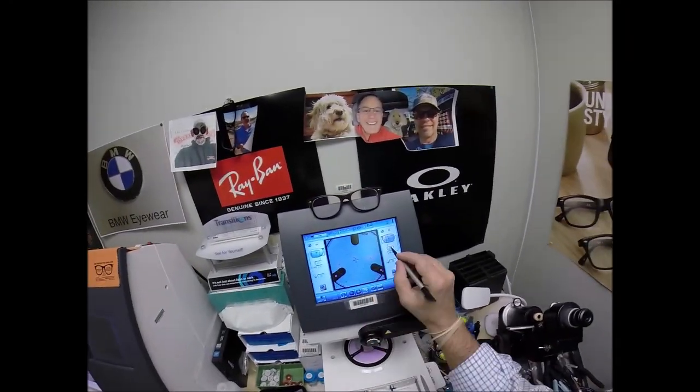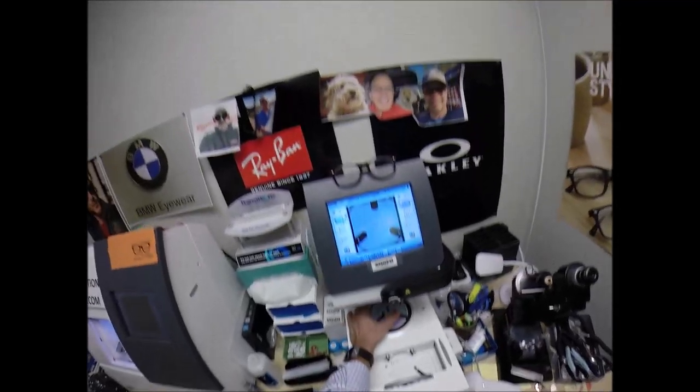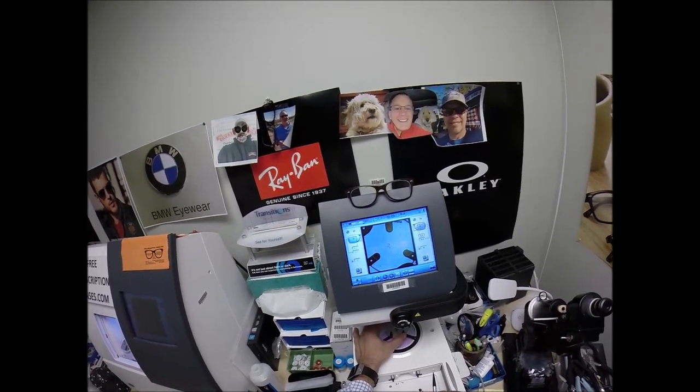So I need to change your pupillary distance for the left eye to 35.5, same optical center height. Get everything laid out perfectly.